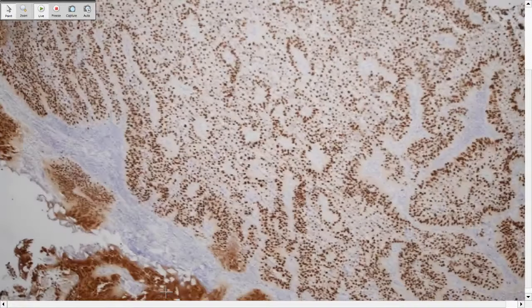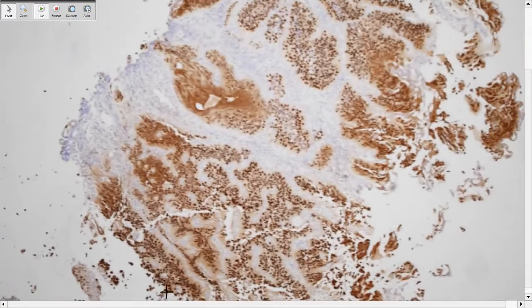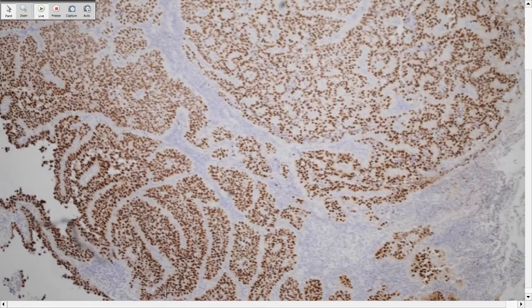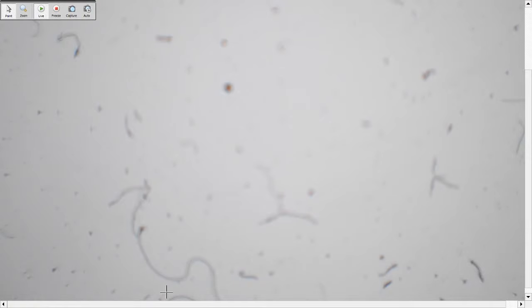He had a TBI question last year, so I chose the wrong one. He asked which marker is more specific, more sensitive for prostate? I chose PSA, but that was wrong. The correct answer is NKX3.1. PSA may be negative, especially if the patient had radiation or chemo, but NKX3 is also a nuclear stain and is easy to interpret. So I favor NKX3.1 over PSA.